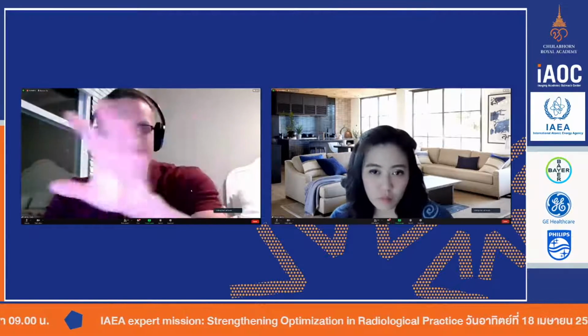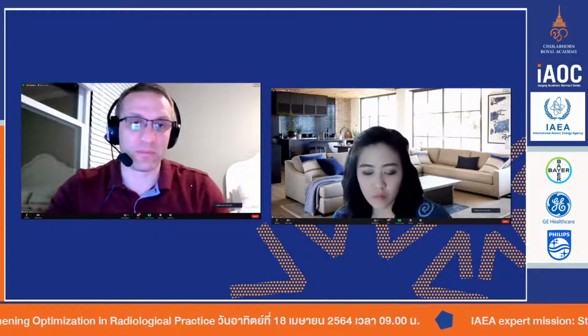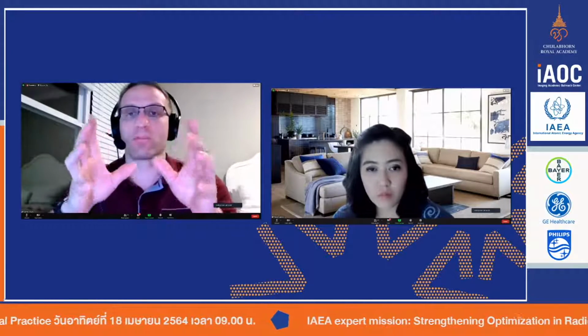As an example, we will always default ours to, say, 7.5. So it starts low. The radiologist walks in and starts imaging and says, okay, I can't really see, I need a little bit more. When they push the next button, it'll go to, say, 15 or maybe 30, whatever we need. Each anatomical location is a little bit different, so you have an option for each one. But the point is you're able to predefine the parameters so the radiologist doesn't have to think.